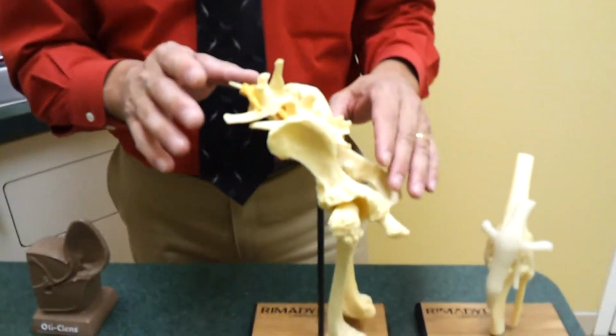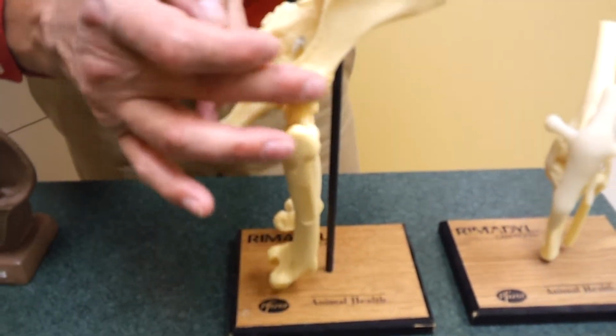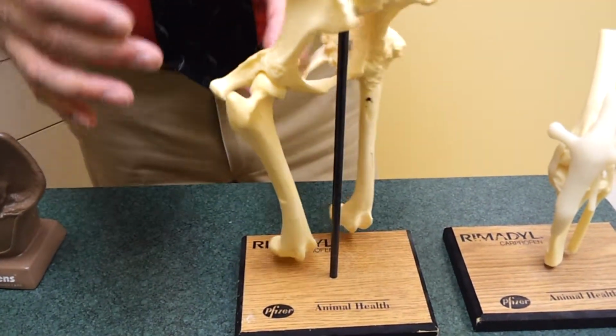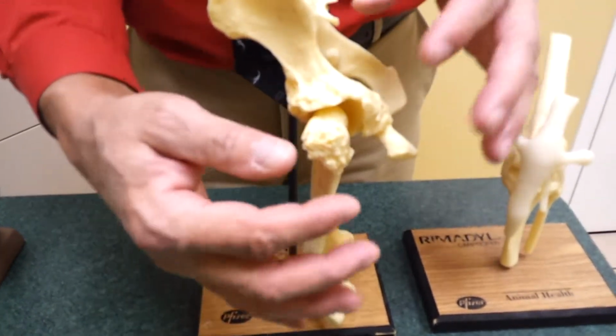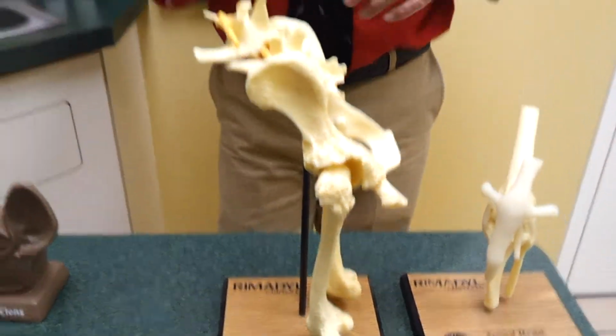So we use it mostly for osteoarthritis. Osteoarthritis is basically arthritis. It's a joint problem. Everyone knows about dogs and hip dysplasia. This shows a dog with a normal hip over here. Nice clean joint. That's the thigh bone. That's the hip itself. And this simply shows a dog that has arthritic changes. Bone spurs, all kinds of arthritic bone buildup. This is the application that we use for our dog Cruiser. But we can use it for any joint.